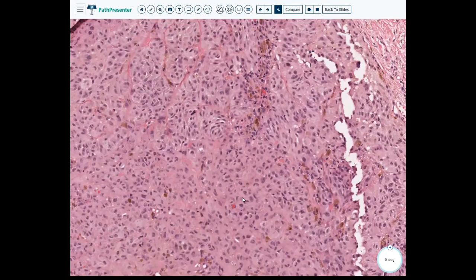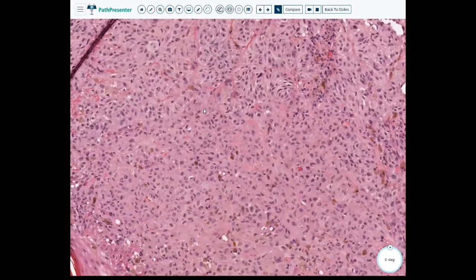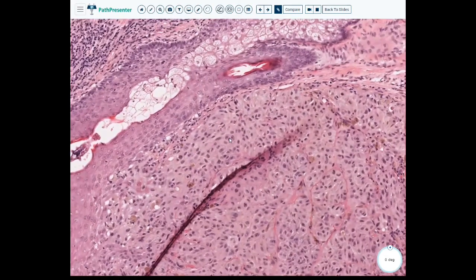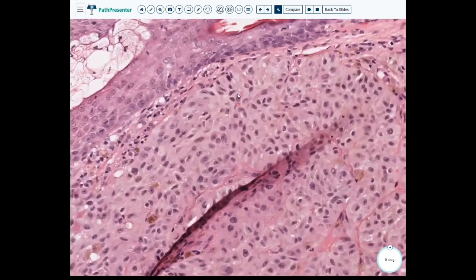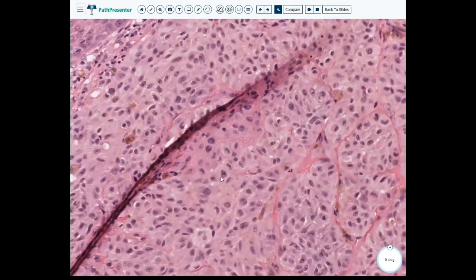So these cells, they're a little more epithelioid, which I think makes them a little harder to distinguish. But remember, your melanocytes can be epithelioid, they can be spindled, melanoma can look like everything, right? That's something that we like to beat on all the time when we're looking at differentials. But we still see the same features where we still have these relatively prominent nucleoli. Look at that one, that's a macronucleoli.